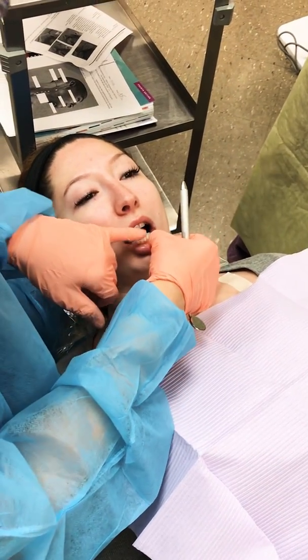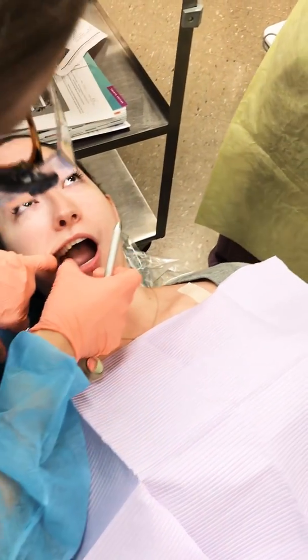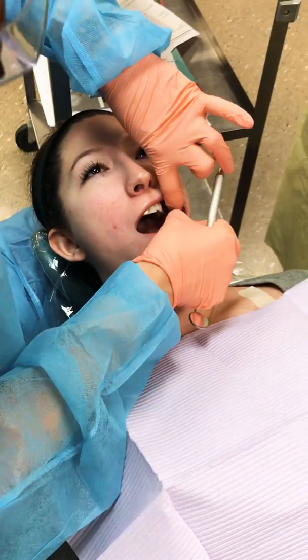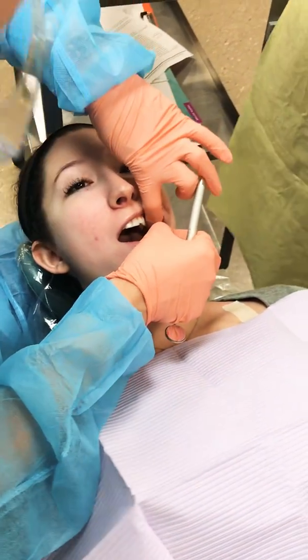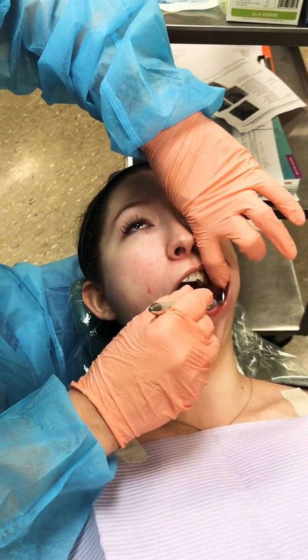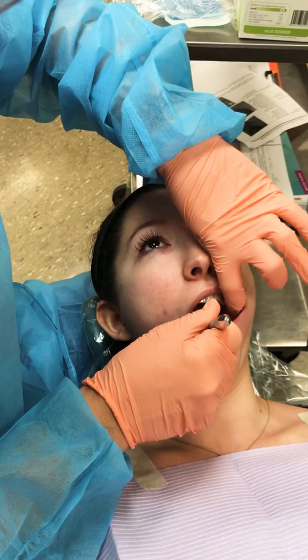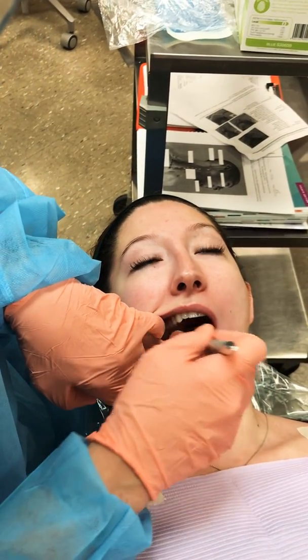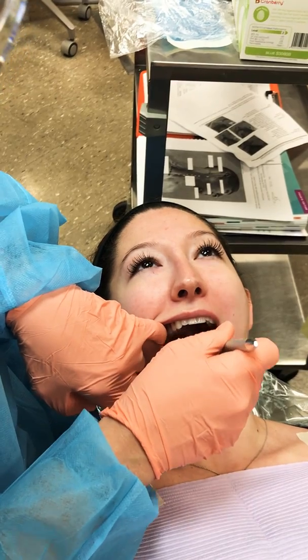Do a cursory screening of her mouth just to make sure there's nothing big to point out. Kind of look around places I can't see really well with my mirror. This is just real quick. You have very nice teeth, Ginger. She does.